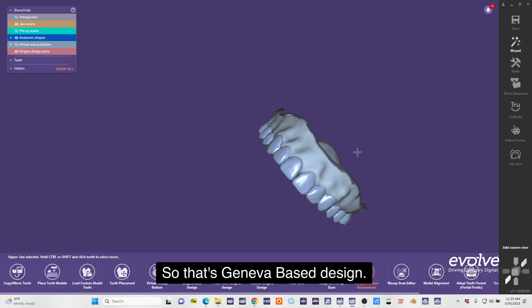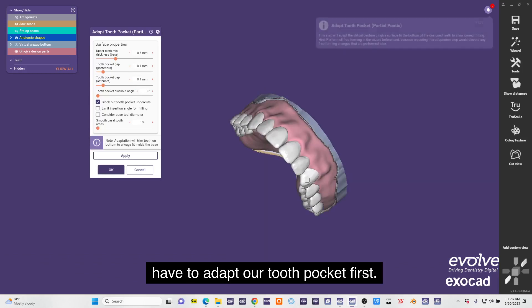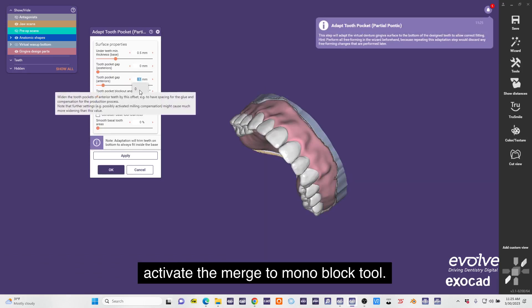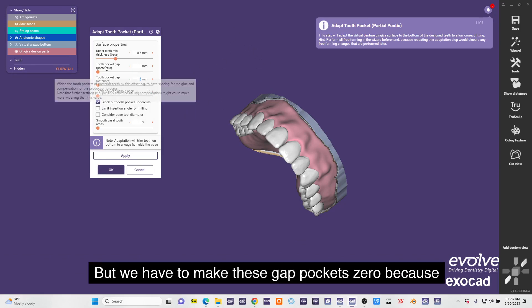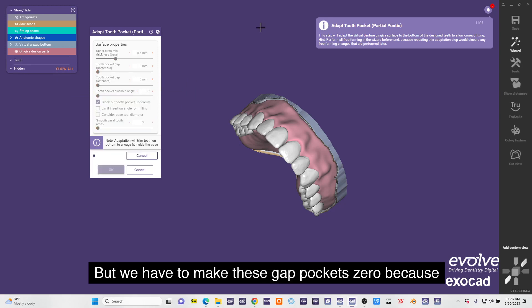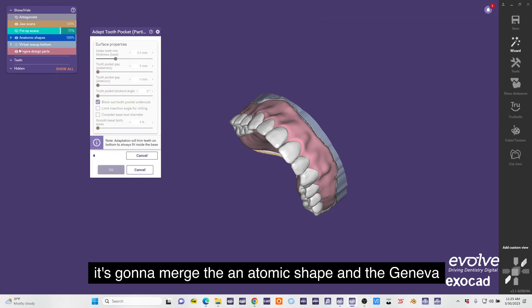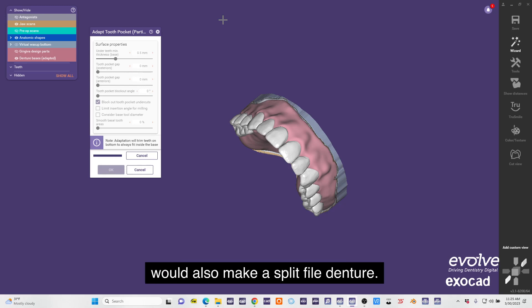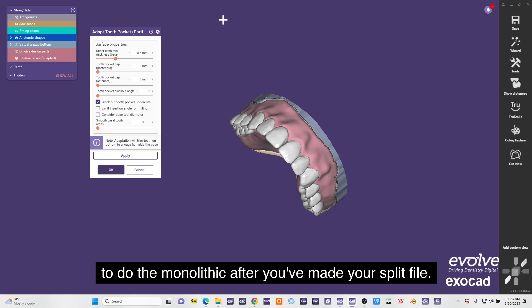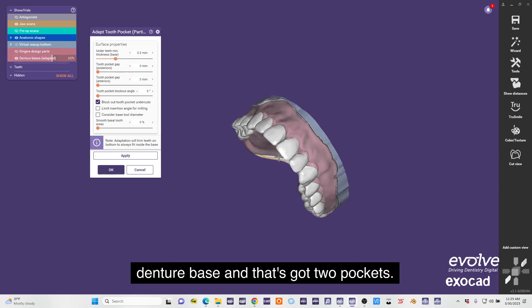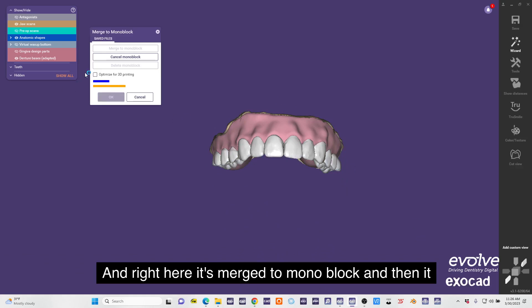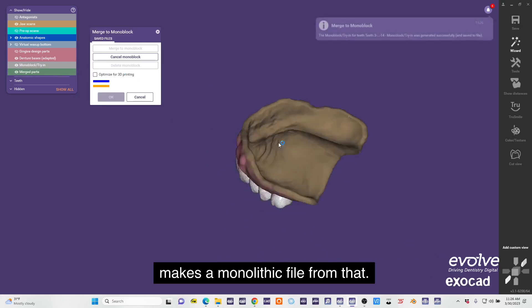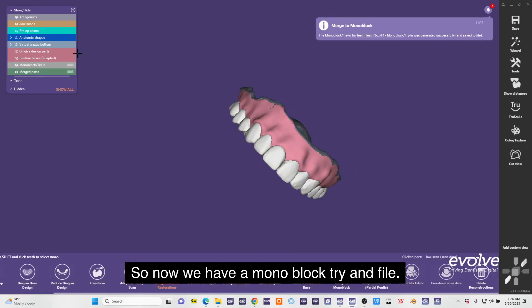Awesome, so that's gingiva based design. To make a monolithic denture we have to adapt our tooth pocket first. In order to activate the merge to monoblock tool, we have to make these gap pockets zero because it's going to merge the anatomic shape and the gingiva base design and it's going to adapt them together as a monolithic denture. But this is how you would also make a split file denture - it just makes you do a split file first and then it'll allow you to do the monolithic after you've made your split file. Now we have an adapted denture base and that's got tooth pockets. Right here is merge to monoblock and then it makes a monolithic file from that. So now we have a monoblock.